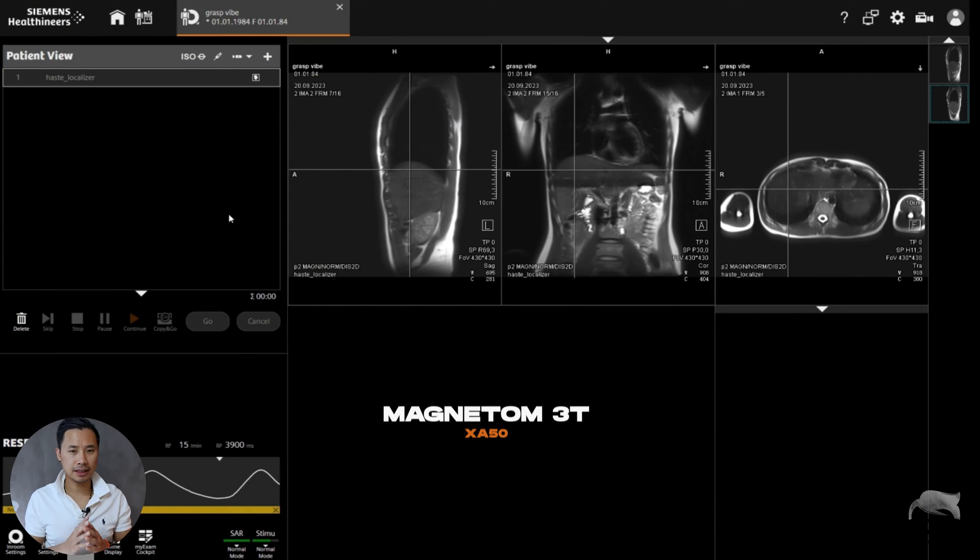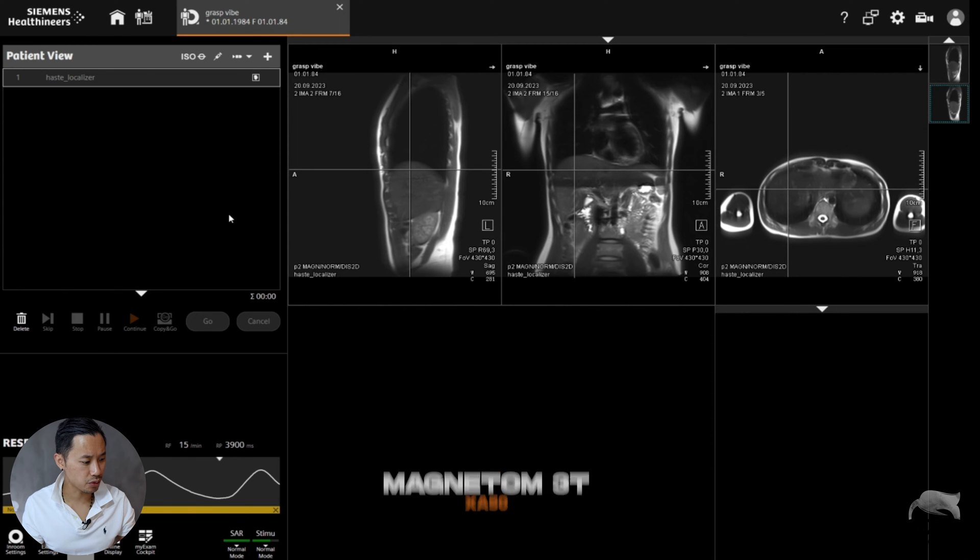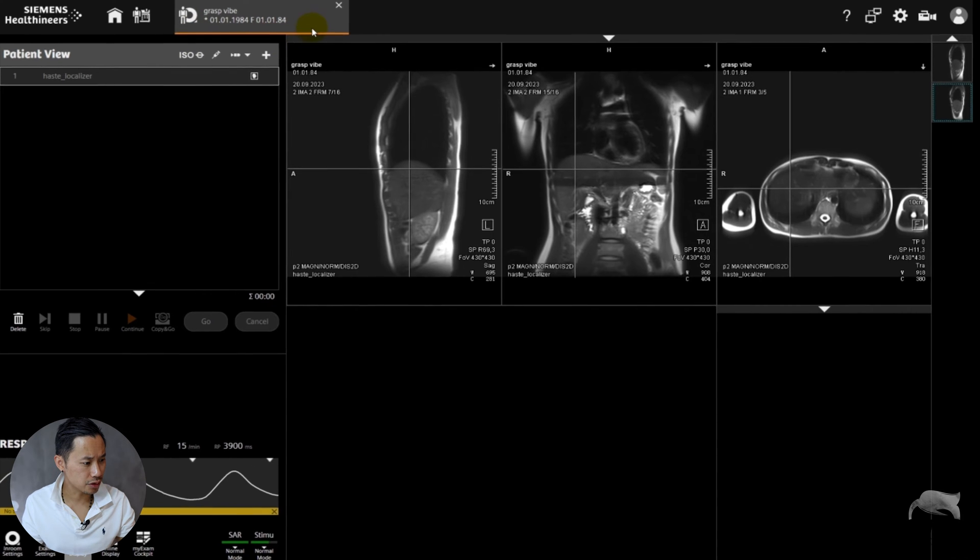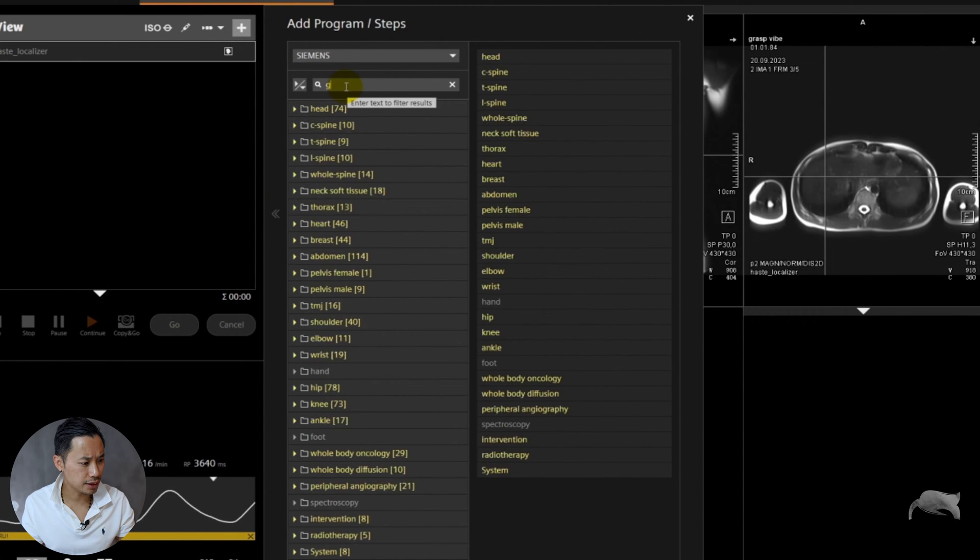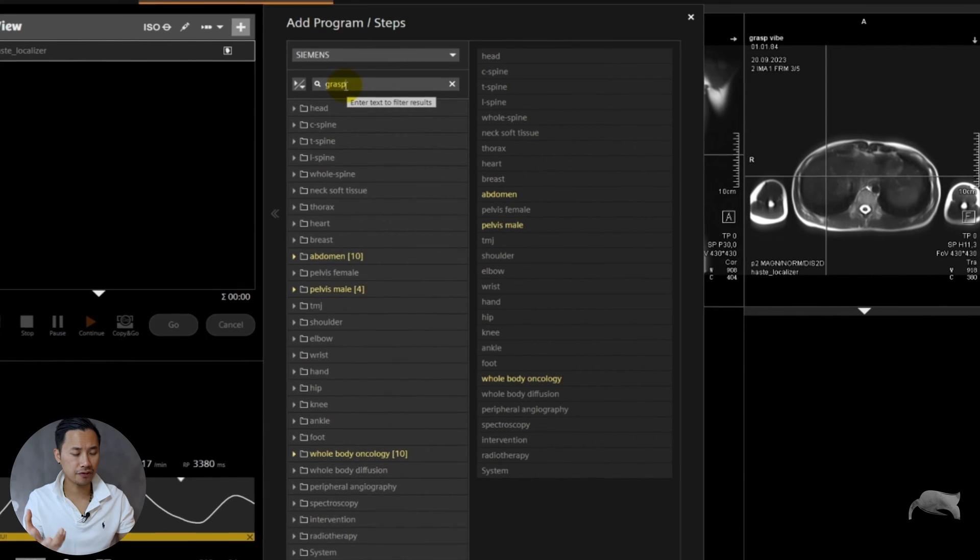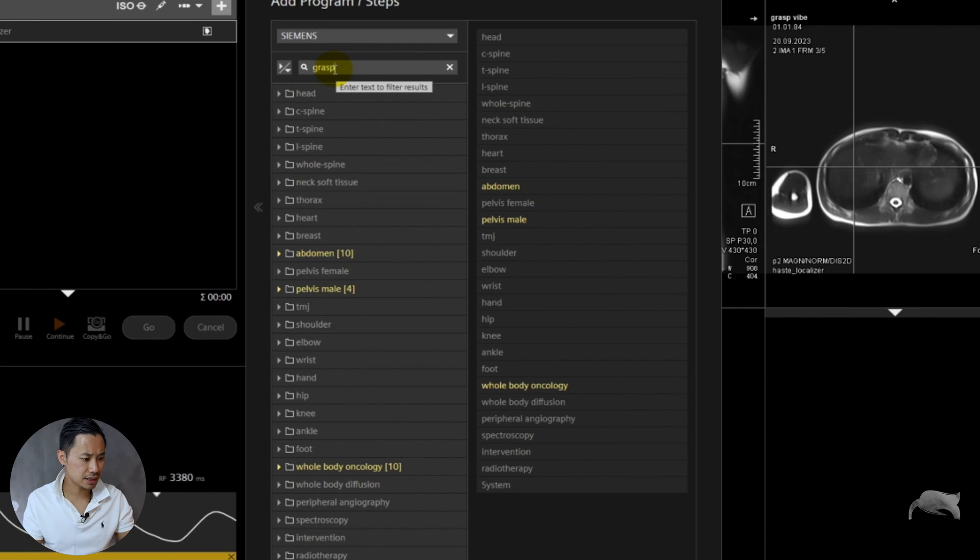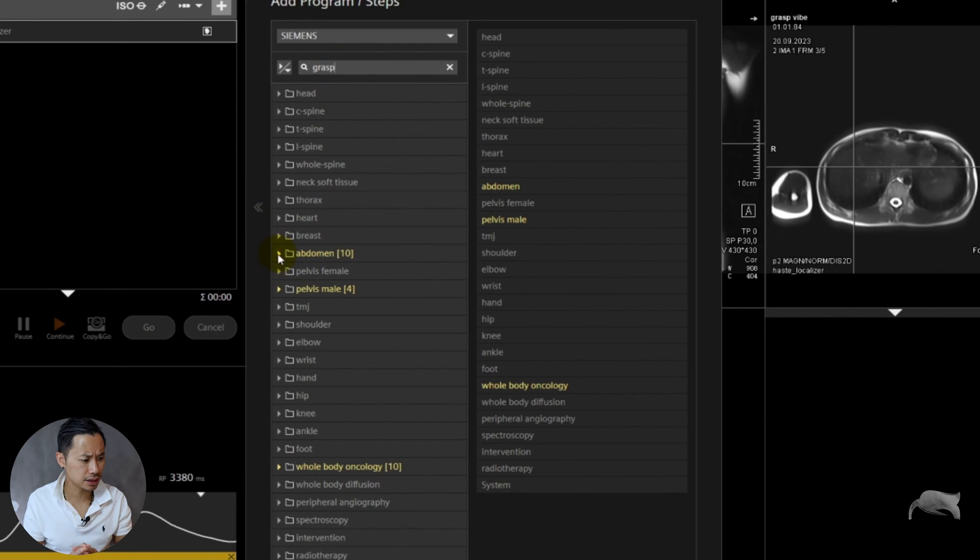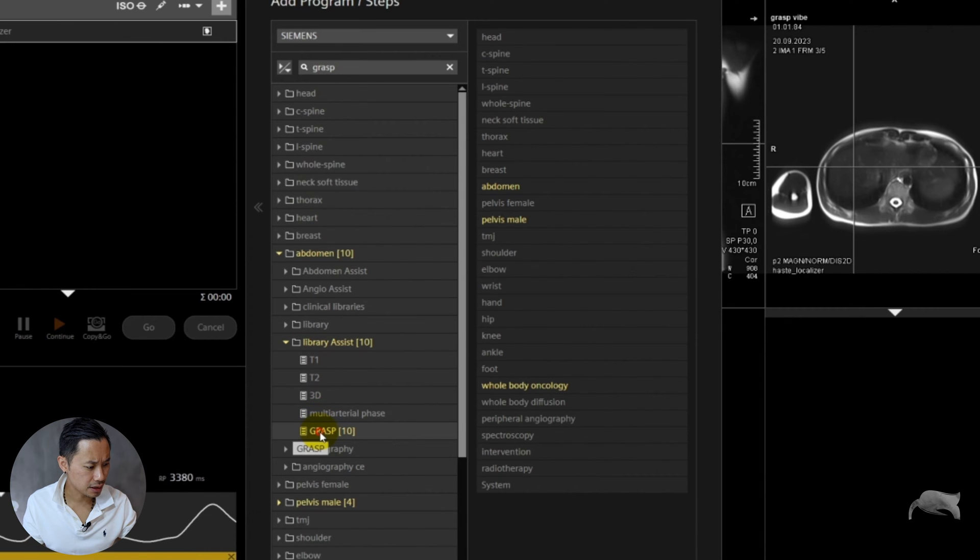We are currently at XA platform. You can see this is 3T but you can also do it at 1.5T. We're going to do some tests here to eliminate the streaking or at least reduce it. We're going to go to the Siemens tree right here and then we're going to go to GRASP. Just write GRASP, GRASP VIBE, whatever, just find it faster.